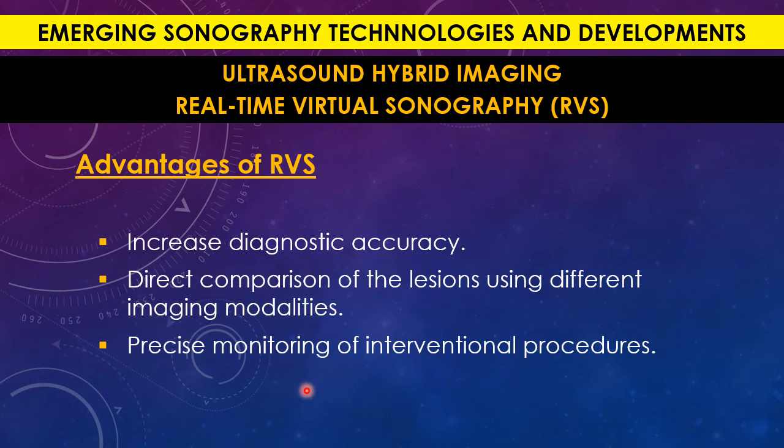So you can see the same lesion by ultrasound, and the same lesion has been detected by the CT or MRI. And this will help also in precise monitoring of interventional procedures. For example, you are doing an injection or you are having ablation performed, or you are having a biopsy. All these interventional techniques that sometimes are done using the ultrasound as a guide, this will emphasize the precise technique of having this interventional ultrasound performed.